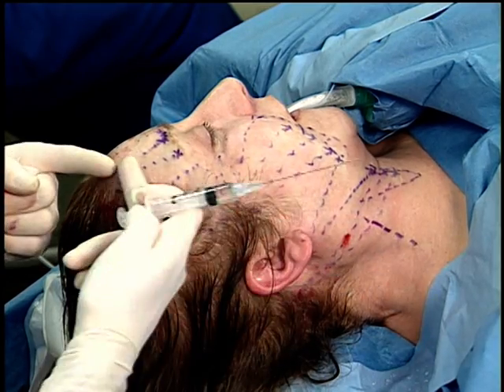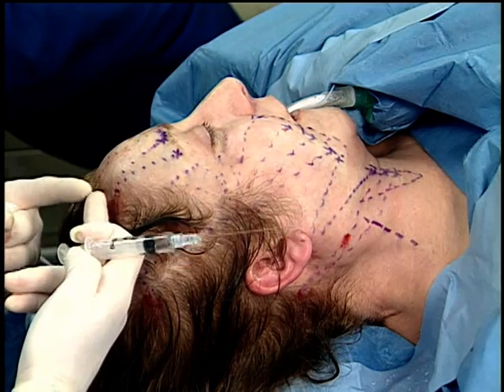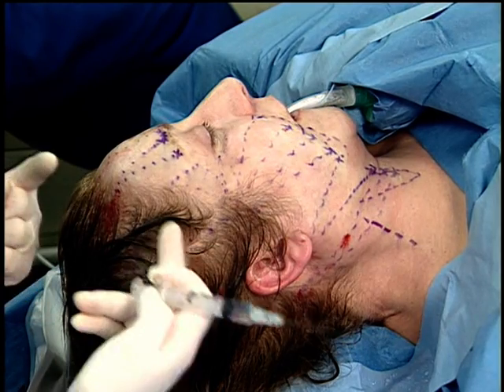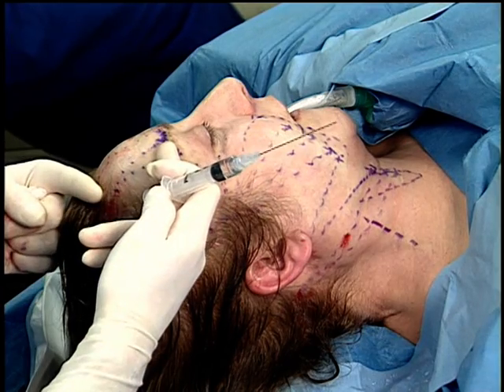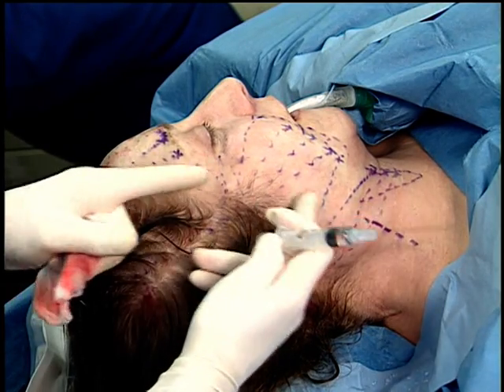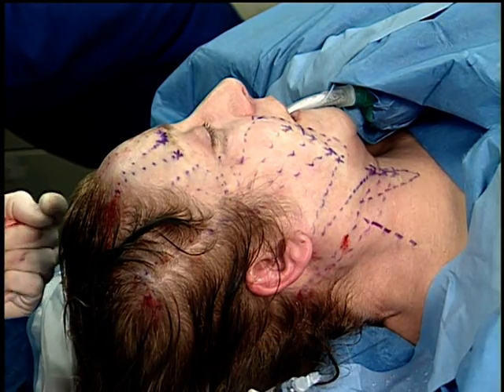We're already seeing some nice vasoconstriction, and we're ready to start deploying our articulus contour threads and performing the loop lift. We'll perform our thread lift of the brow, our thread lift of the cheek, the jowl, and the neck in segments, so you can follow each segment as a chapter point.